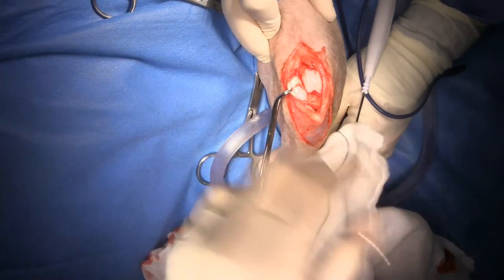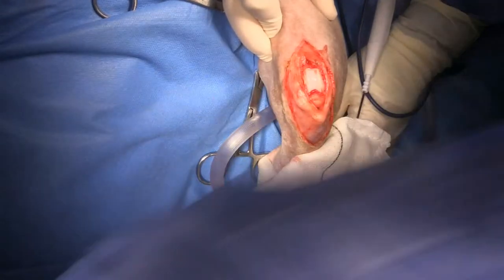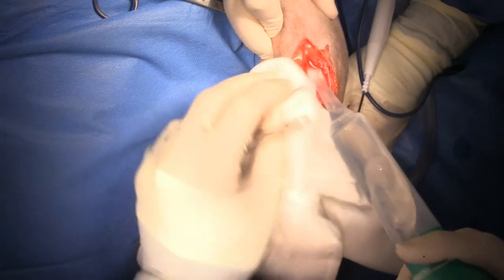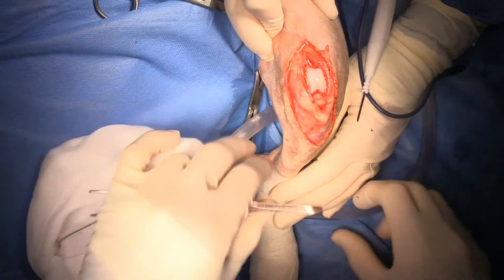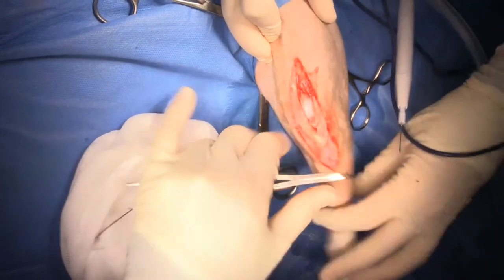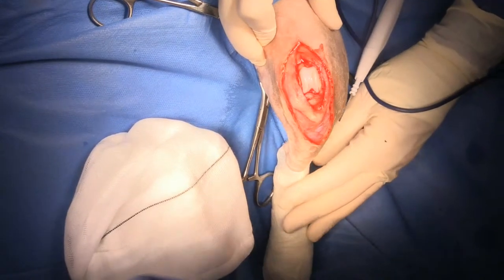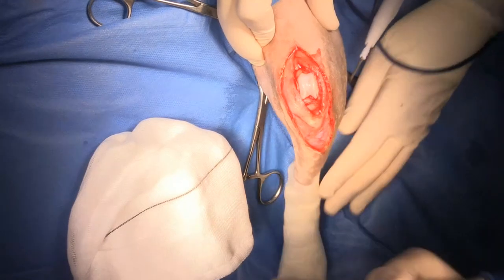I'm now finished with the intra-articular portion of the surgery. I do not close the joint at this point because I want to do my tibial crest transposition first, and then if I'm not happy that it's stable, I can always go back and do a trochleoplasty later.